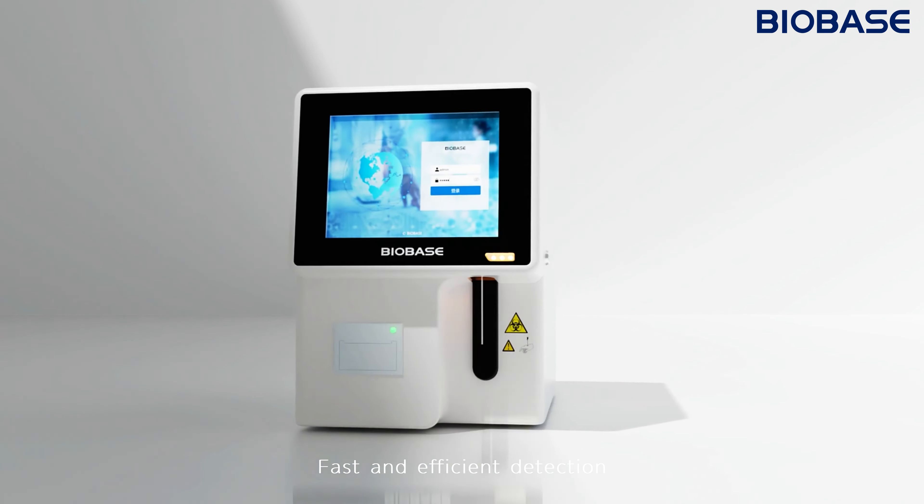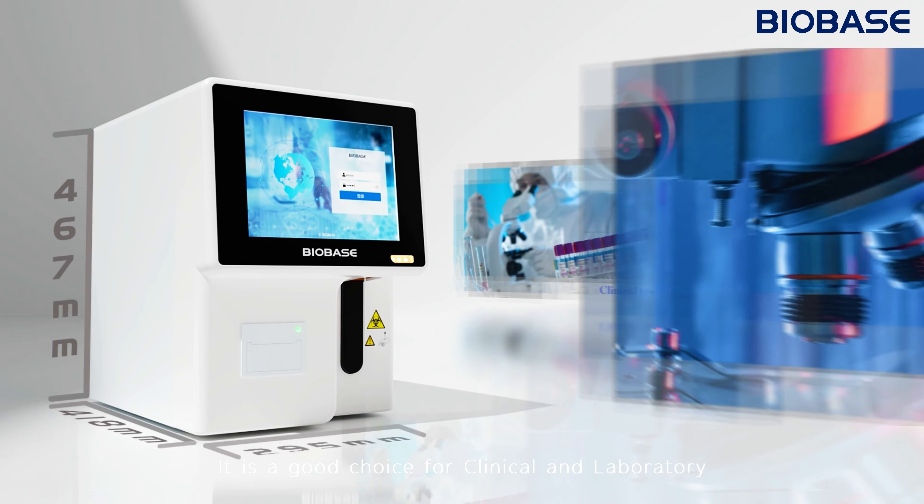Small size, fast and efficient detection — it is a good choice for clinical and laboratory use.